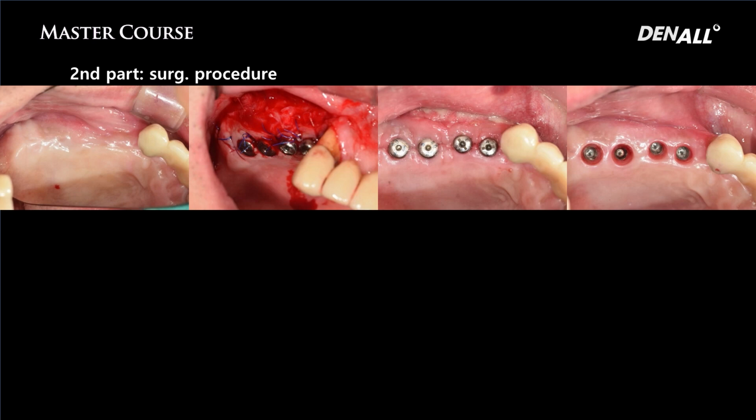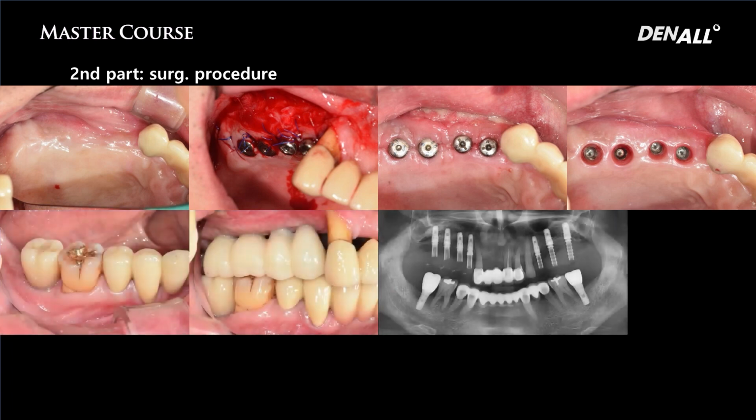Moving to the right side, implants were placed in the upper right. Secondary surgery was done in number 47. Simple implant restoration was done. Restorations were delivered for upper posterior. The patient was able to chew on food. After that, I moved it to anterior area.